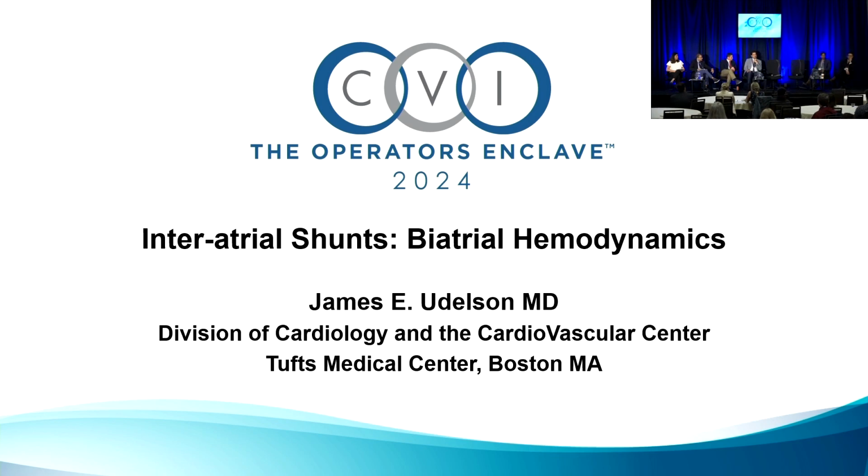So they shrink over time. I remember that has been demonstrated. So here, I guess I would say they don't shrink. So we know, like in the Alleviant approach, out to 12 months in all the phase 2 trials, everyone had either TEE or CT. Everything was patent, size was exactly the same. And then, of course, the implants, almost by definition, the size was the same. So, in that sense, you have a stable shunt over time.